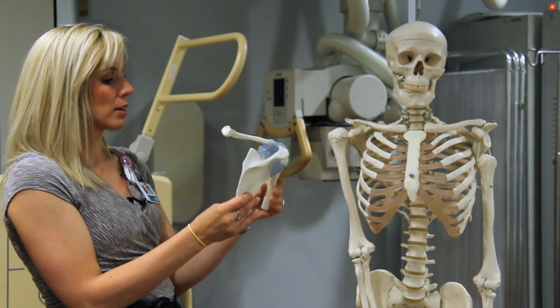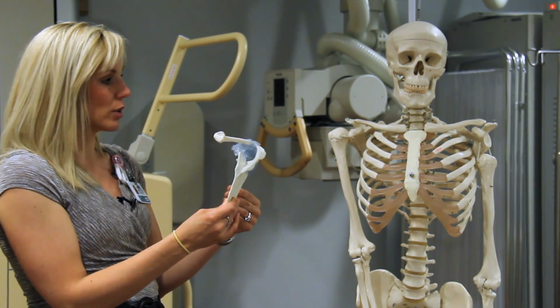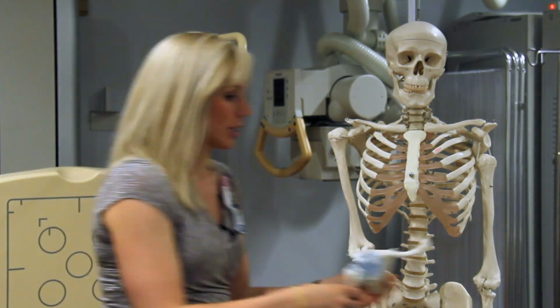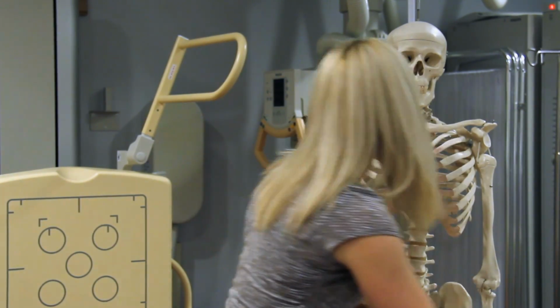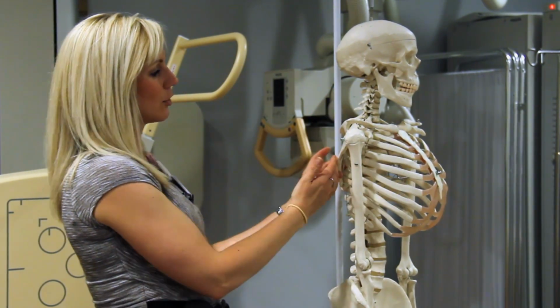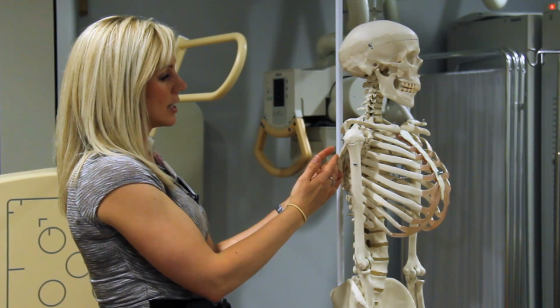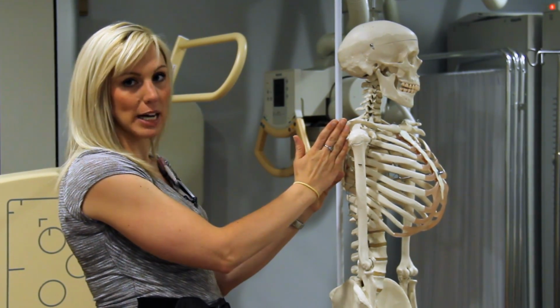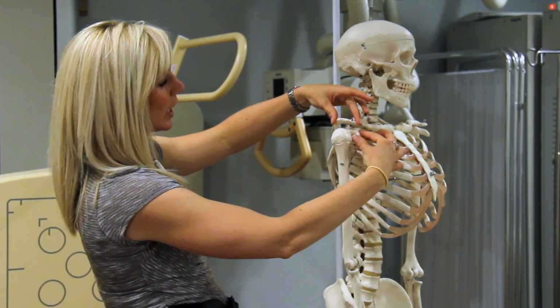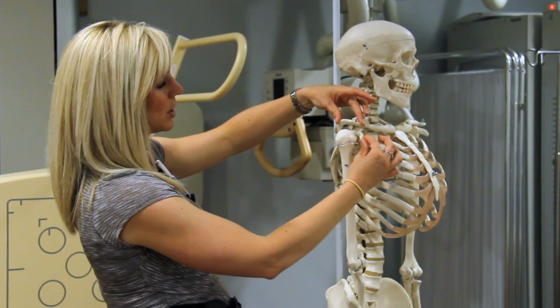As far as the PA projection, this is the anatomy that you would be viewing there. The last view that we use is the Y view or the lateral view, shown better on this one. In the lateral view, what we see really well is the more lateral aspect of the scapula. We are seeing the acromion and the coracoid and the relationship of these to each other.